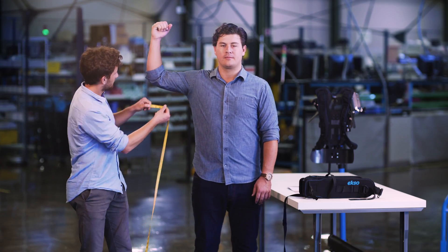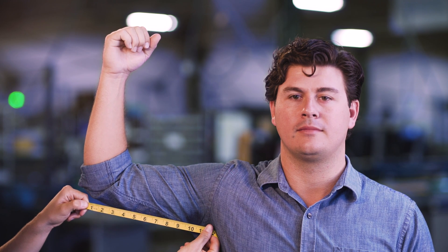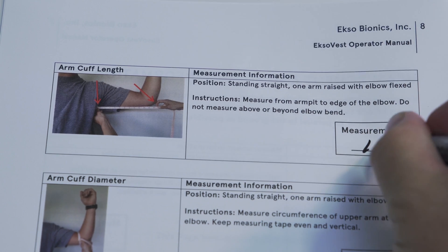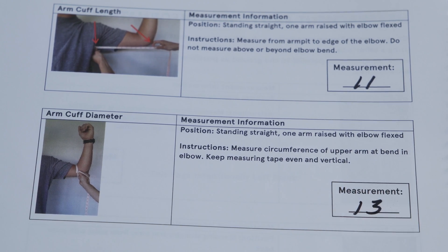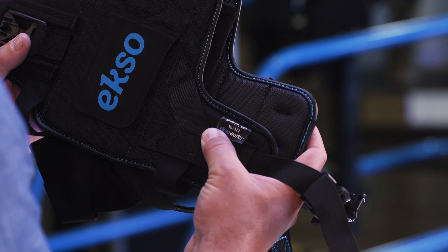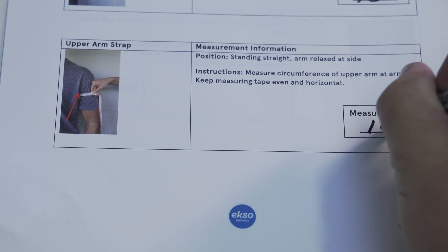You'll need to take two measurements for the arm cuffs. First, measure your upper arm length from your armpit to the edge of your elbow, then your arm circumference just above the elbow joint. Finally, measure your bicep diameter to find the arm strap size.